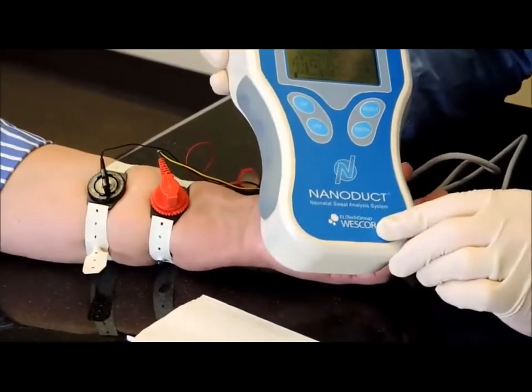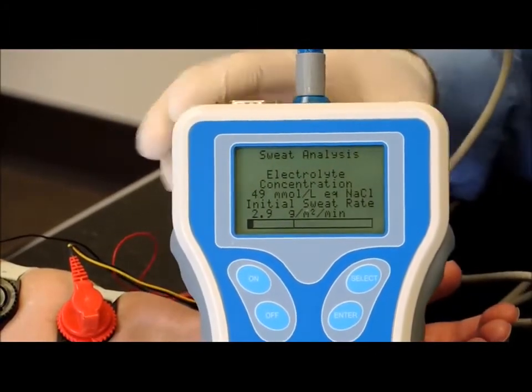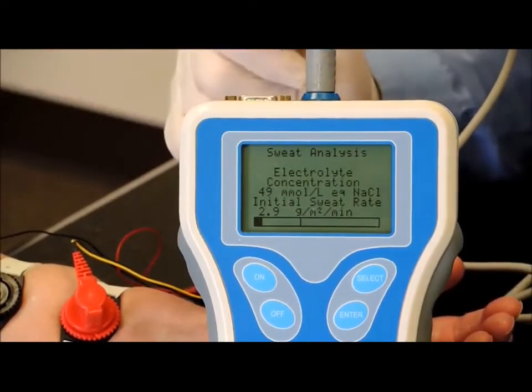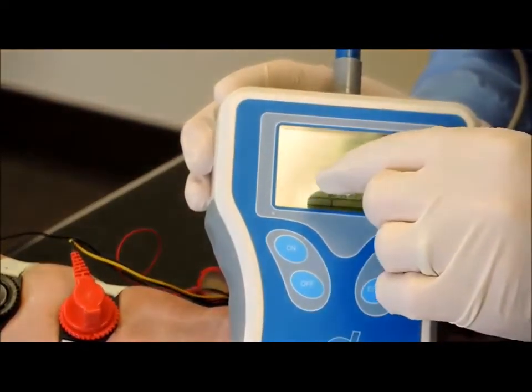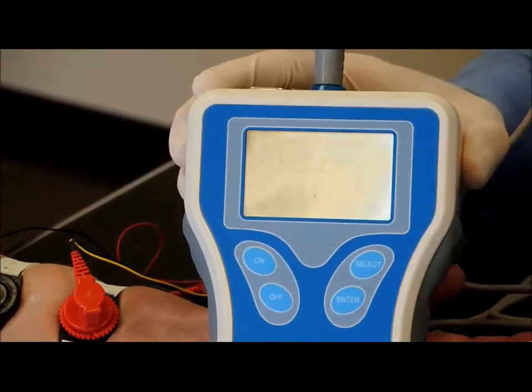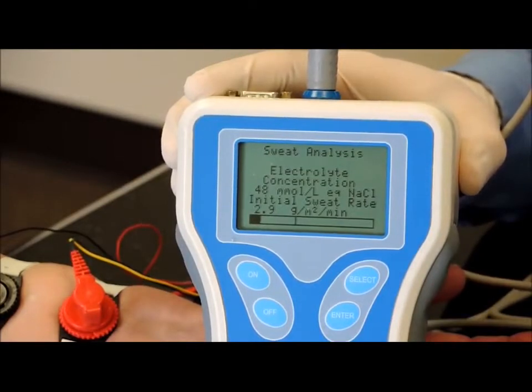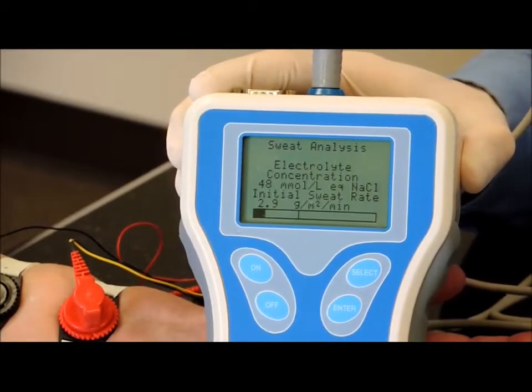So the first reading is 49 millimoles. That is the conductivity value of the sweat coming from the patient. You also see below she has a sweating rate of 2.9, so that's her sweating rate. It needs to be above 1 in order to be valid according to the CLSI sweat testing guidelines. So we're well above that 1, which is good.